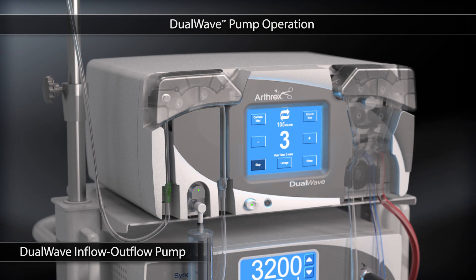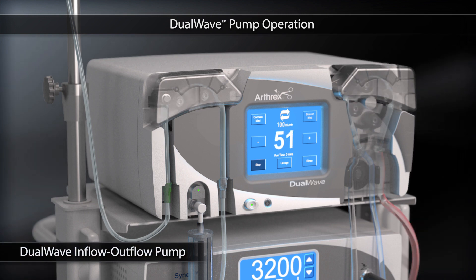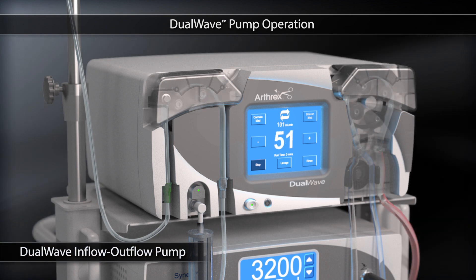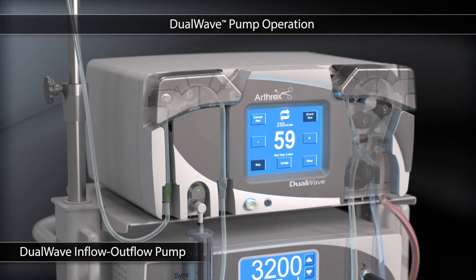The Arthrox Dual Wave Arthroscopy Pump functions as both an inflow-only and inflow-outflow pump. When used as an inflow-outflow pump, the dual wave automatically adjusts inflow to match outflow, which allows the optimal overall pressure to be maintained.